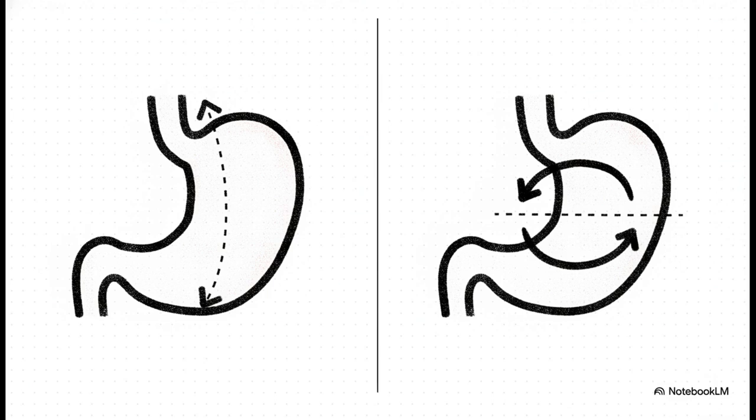With an organoaxial volvulus, the stomach rotates along its long axis. That's the imaginary line drawn straight between the cardia and the pylorus. Think of the stomach folding up on itself lengthwise, kind of like a hot dog bun. Conversely, a mesenteroaxial volvulus features a rotation around the short axis. This means it twists perpendicularly right over its mesenteric attachments. Getting a solid grasp on this geometry is absolutely key to understanding how they're going to show up on your scans.